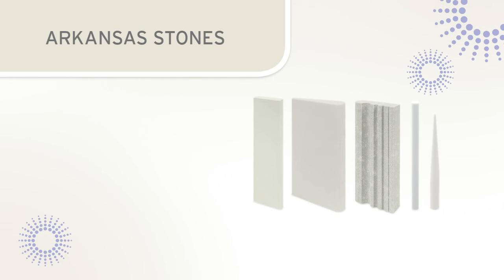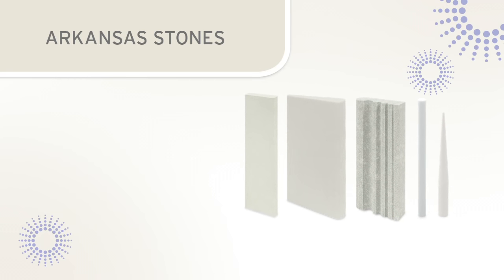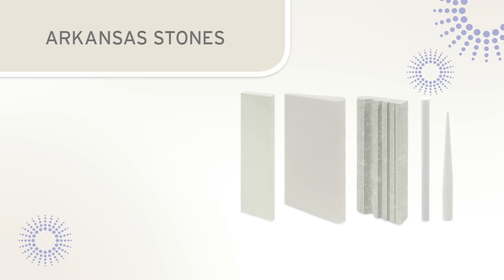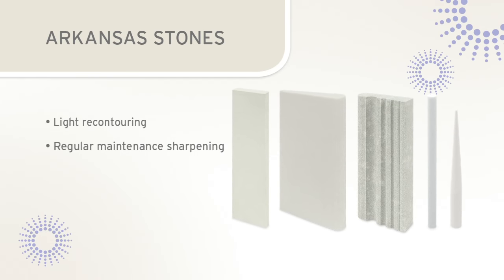Arkansas stones are available in flat, wedge, cylindrical, and conical shapes. The Arkansas stone is ideal for light recontouring and regular maintenance sharpening of scalers and curettes.